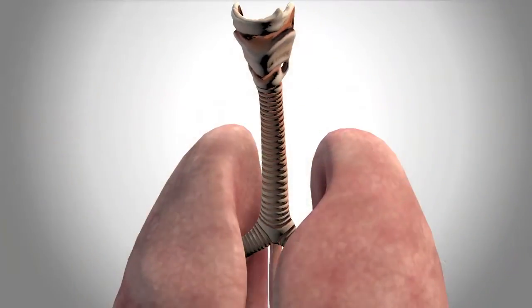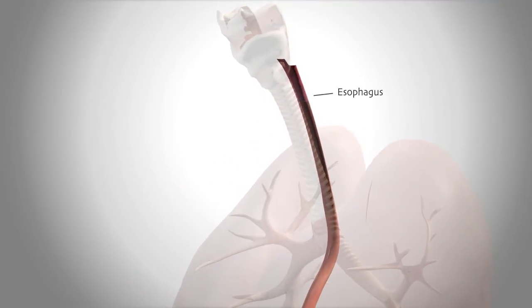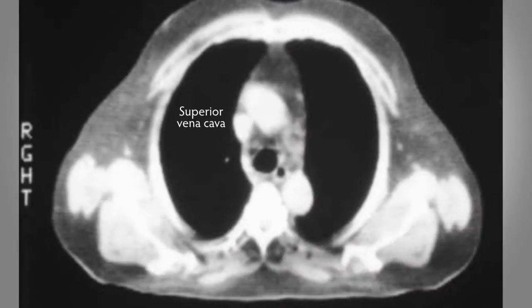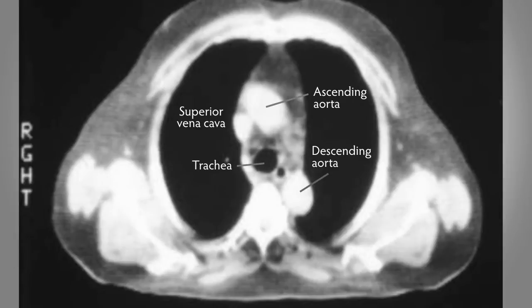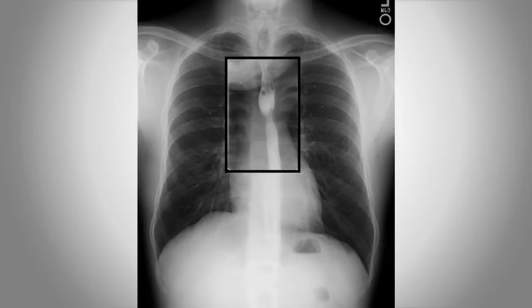Located behind the trachea and the tracheal bifurcation is the food tube, or the esophagus. If we look at this cross section, we can see the superior vena cava, the ascending and descending aorta, the trachea, and just behind it the esophagus. If we have the patient swallow radiopaque contrast material like barium, we can see it fill the esophagus from top to bottom by peristalsis.